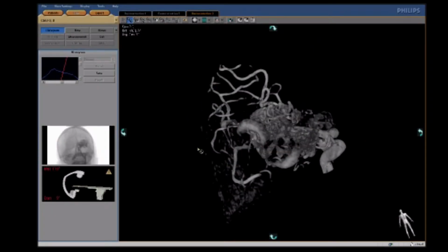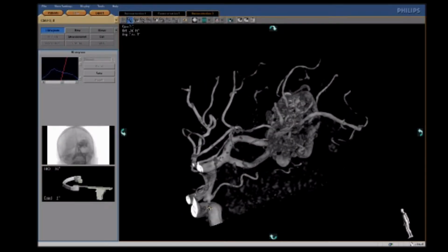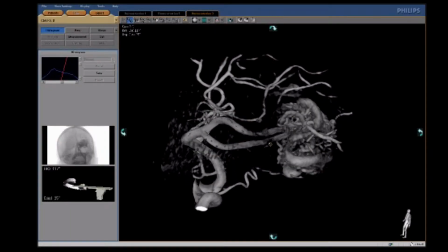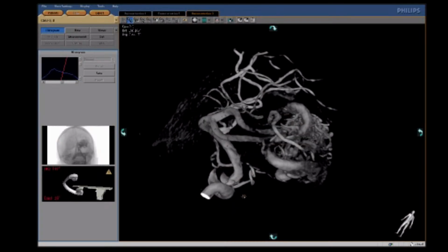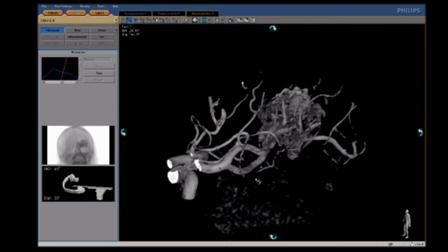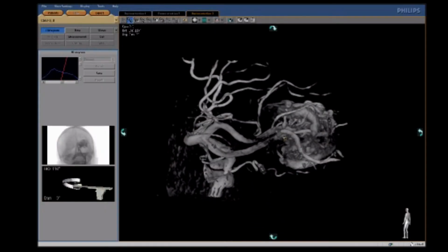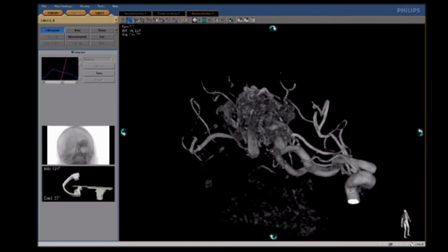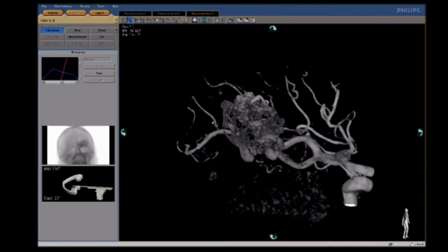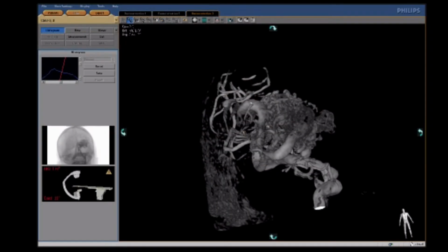It looks like aneurysm, huh? Yes, there is aneurysm on choroidal segment. It might be fenestration, huh? Okay, it's aneurysm. Two main branches of the MCA going, and also choroidal artery, anterior choroidal, is joining the AVM. It's not so comfortable situation.